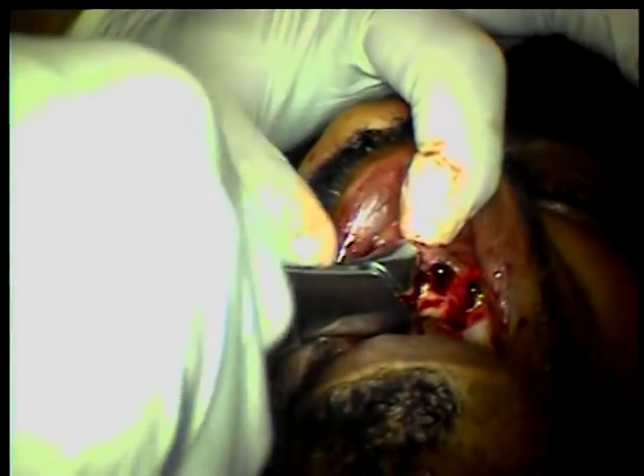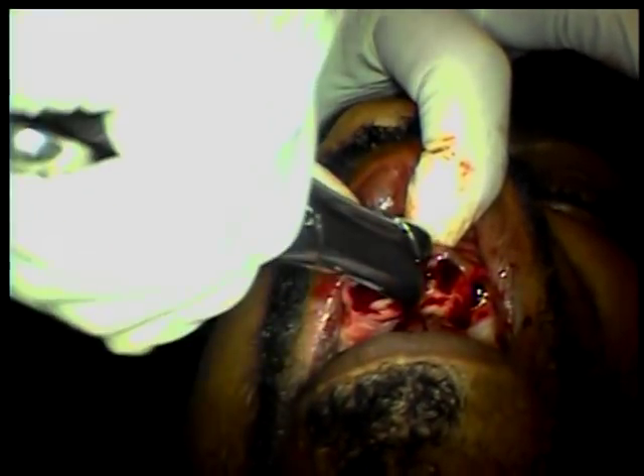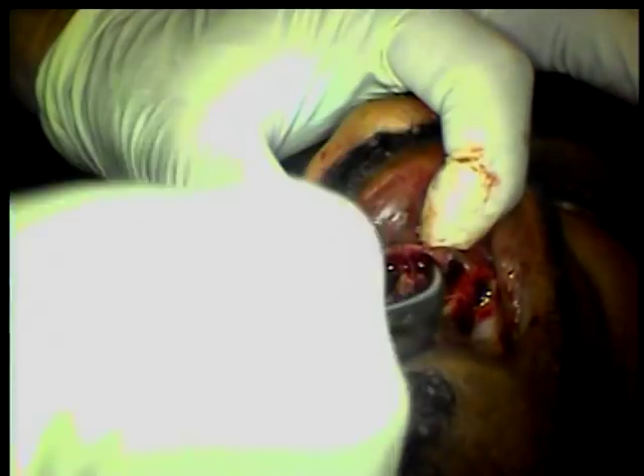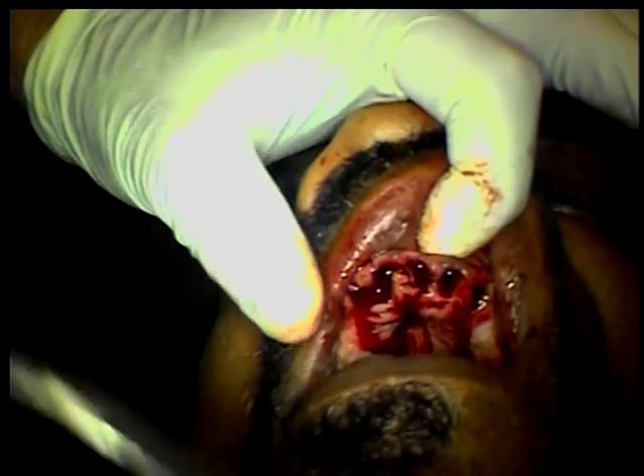I'm not going to squeeze — I'm going to just basically hold the instrument. Once the instrument is set, I'm going to move my wrist: buccal, lingual, buccal. And I move it up — buccal, lingual.